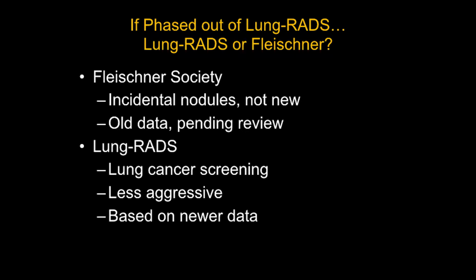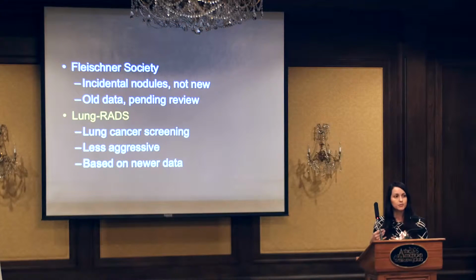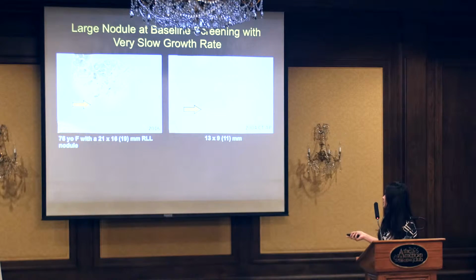It's based on all the data from the lung cancer screening trials, and it addresses new nodules and changing nodules, and the recommendations are usually a little more spaced out. Now we're giving it a little more time for the people when we recommend follow-ups for the nodules.